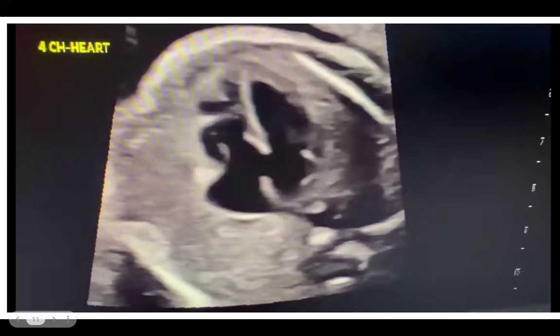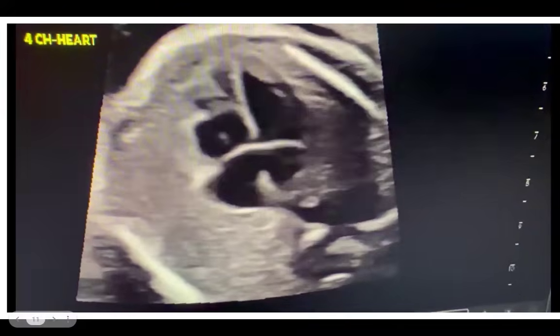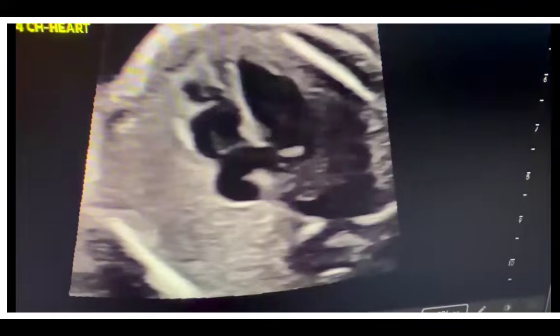We're still going to do our evaluation because she's due for her echo coming up. But right away, we see that there is a linear insertion of the AV valves, and there is no primum here. So that leads us to one of the two. I will know by our next meeting what the cardiologist came up with once we did further investigation.